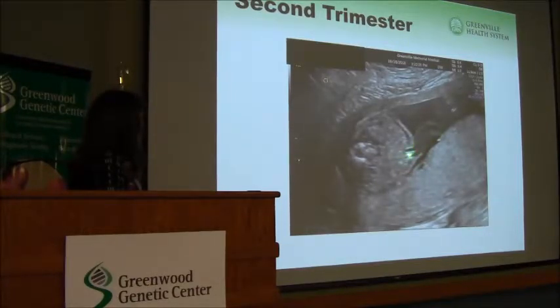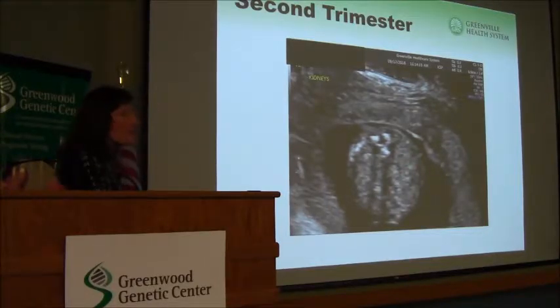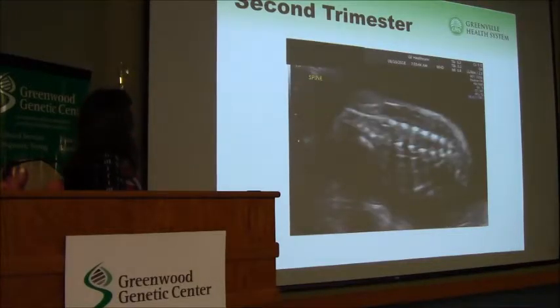This right here is the umbilical cord coming in, again a cross section through the abdomen, the spine's back here. We want to make sure that there's nothing herniating here, that there's no tissue outside this ventral abdominal wall. Moving down the fetus in cross section on either side of the spine here, you can see the 3 echogenic centers that make up the vertebral column. You see the kidneys, and you have to use your imagination. But there's no cystic structures like you might see with cysts. There's no dilation to the renal pelvis like we see with hydronephrosis. And I'll come back to the kidneys in a minute.